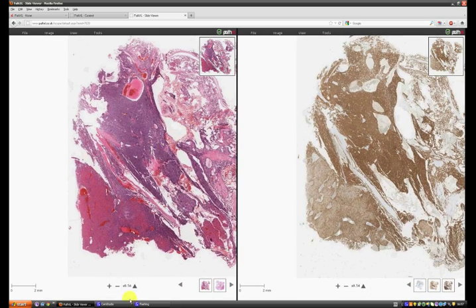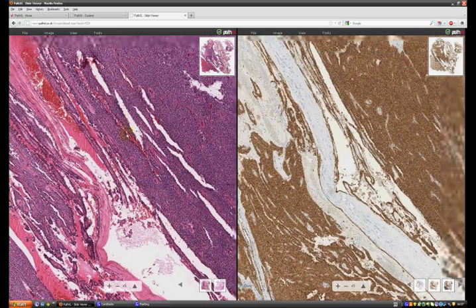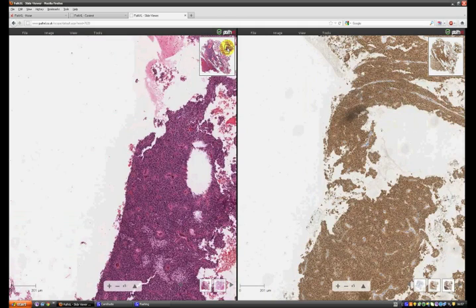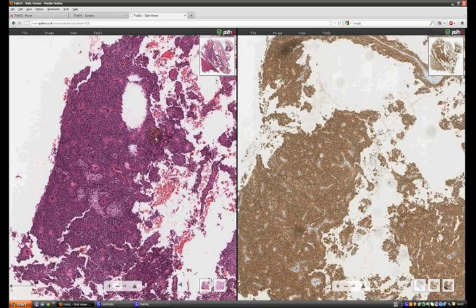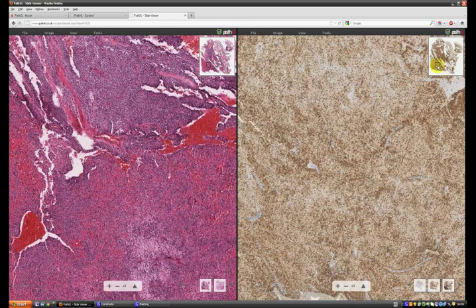If I increase magnification on one slide, the other slide also increases to the same magnification and shows the same region of the slide. Currently, up to 4 slides can be opened simultaneously for concurrent review. This is an extremely useful approach to teaching comparative histology, the importance and comparison of different stains in histology, and for comparing different biomarkers, immunohistochemistry, DISH, FISH or CISH, in tissue and cellular pathology.